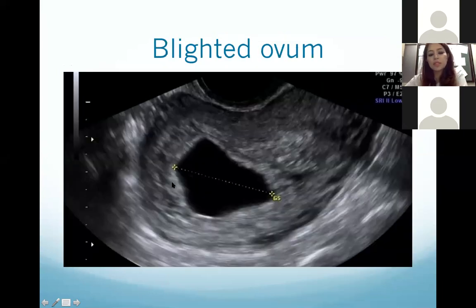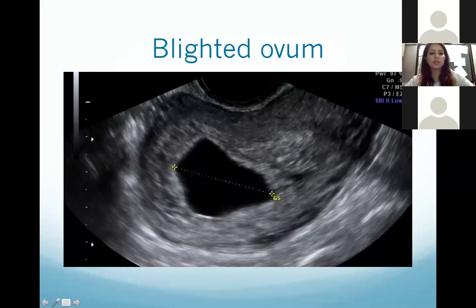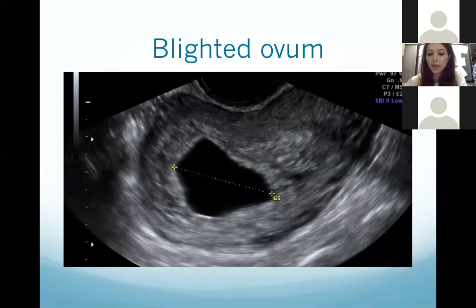Here you can see a large gestational sac but there is no fetal pole and no yolk sac inside this sac. This is a case of a blighted ovum.